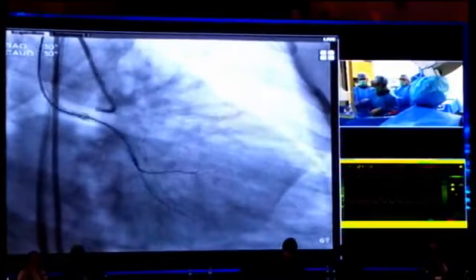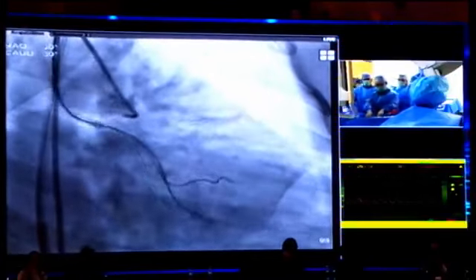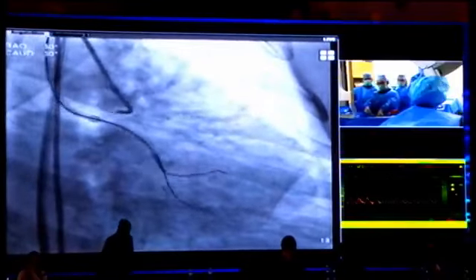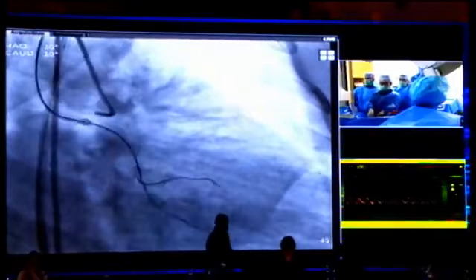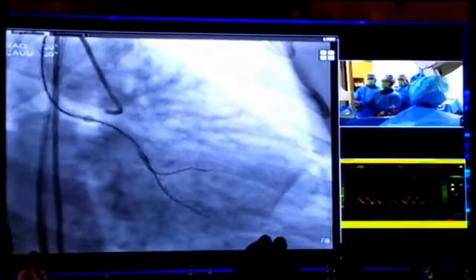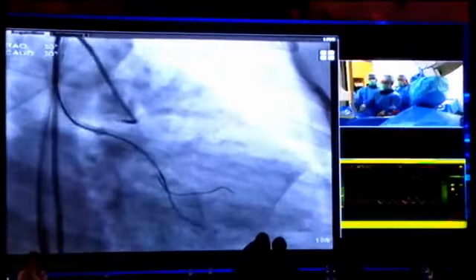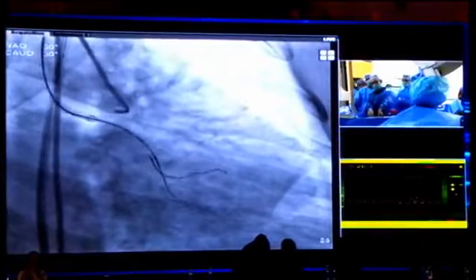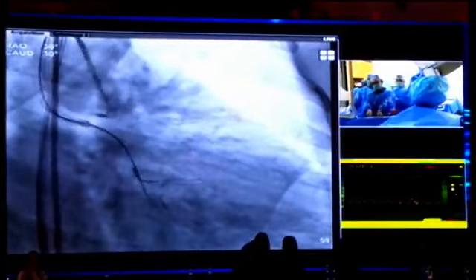Okay. The connection, this one? Okay. And what procedure is best in this situation? So it looks like this guide wire passes through the distal true lumen, but this guide wire passes through the small branch. I don't know where.